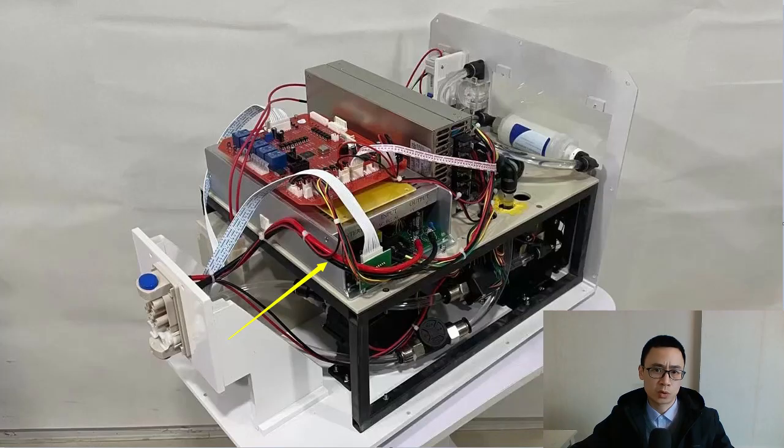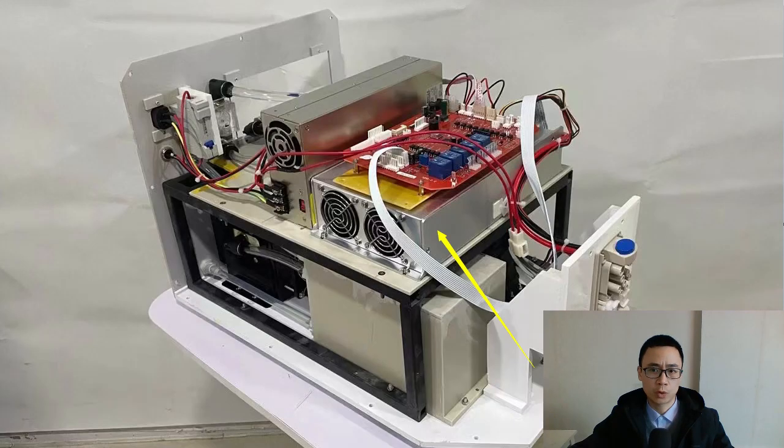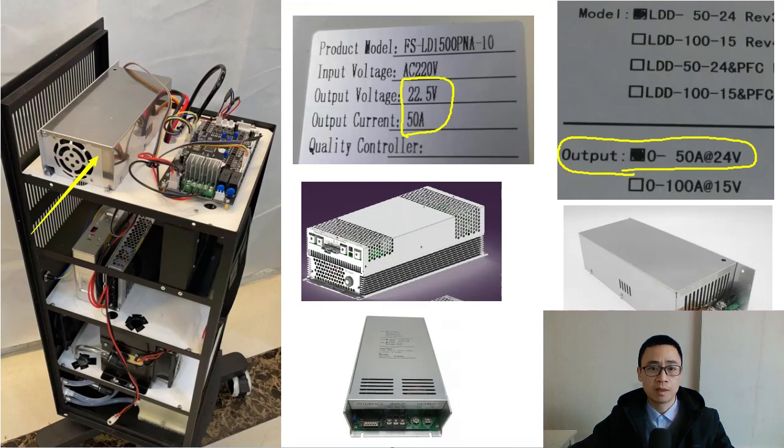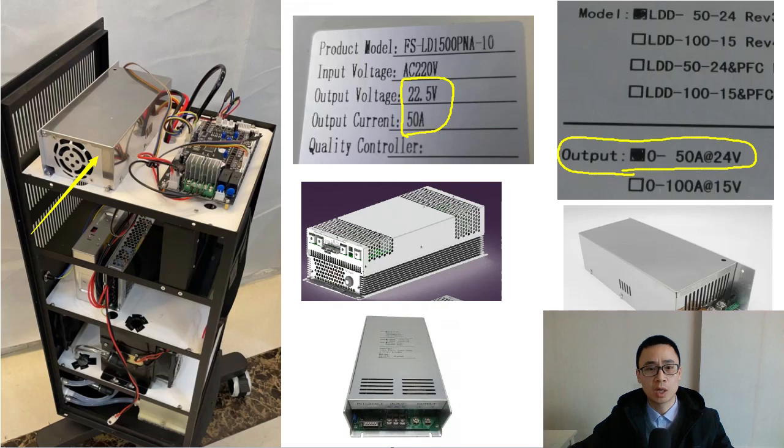The other thing you need to do is open the machine and check the voltage and current of the diode laser power supply. We need to know if it can drive a high power laser stack. It may also need to be replaced with a high power supply.